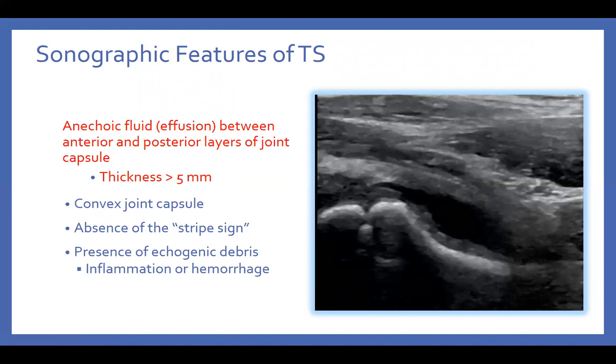So here we go. What are the sonographic features? How do you diagnose it on ultrasound? Now you've learned the technique. Now, what are the features? I mentioned a little bit about normal anatomy. Now, what are the features of transient synovitis? Number one, you look for fluid. Is there any fluid in that space? In this situation, there's fluid. I see that in there. So if I want to measure the effusion here, I'll go from here all the way to there.